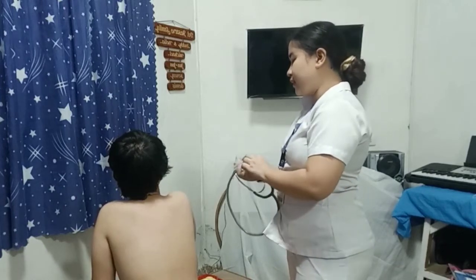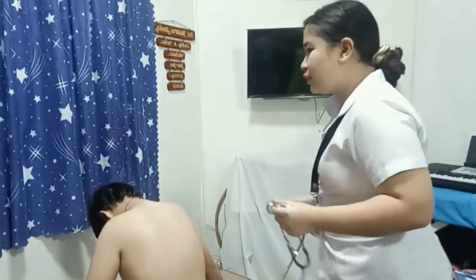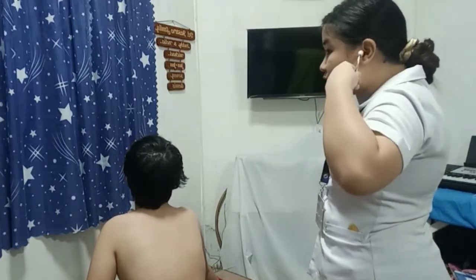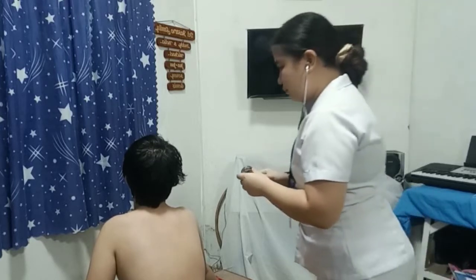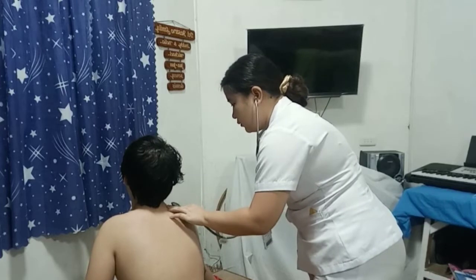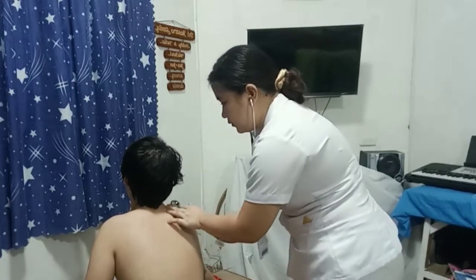So I am just disinfecting the stethoscope. So what I want you to do is to breathe deeply through your mouth, Kevin, okay? This is to avoid transmission of sounds that may occur during nasal breathing, okay? Okay, so inhale, exhale. Again.